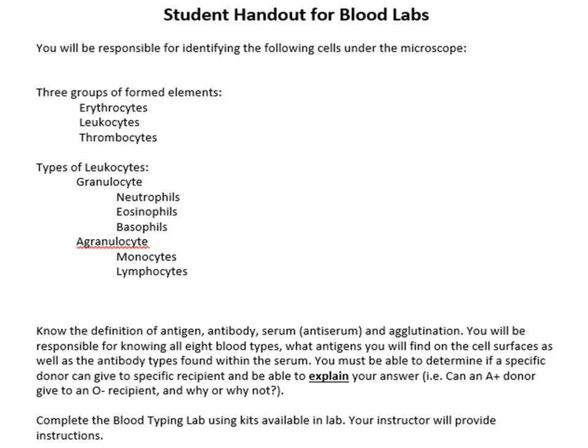So what we're looking at is blood. And the first thing we're going to talk about is the components of blood. Now, one of the components is this thing called formed elements. The formed elements are going to be cells. There's going to be 3 different types of cells. But the other thing is called plasma.